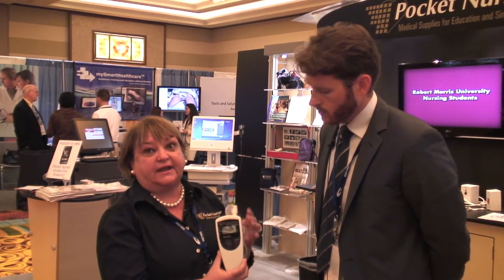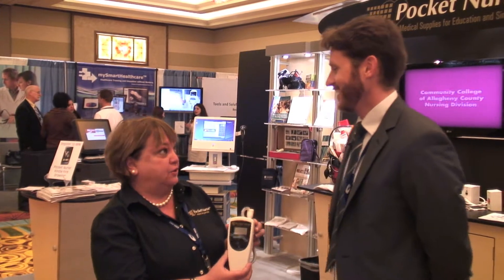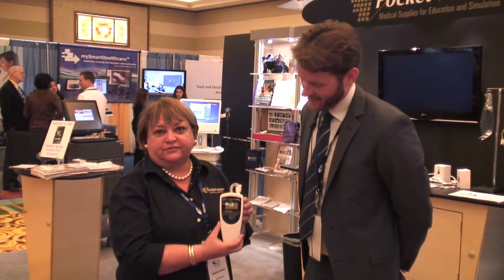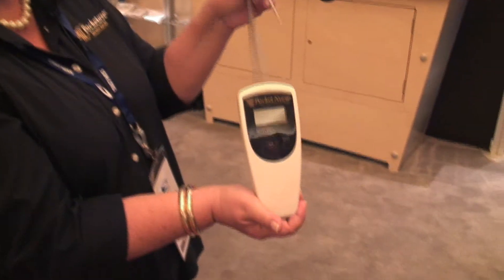This was actually designed by one of the PocketNurse customers. They came to us and said, 'I have a design.' And we were able to take this to a manufacturer. It is available in early spring. You can preorder them now.